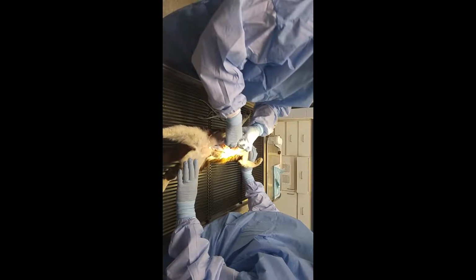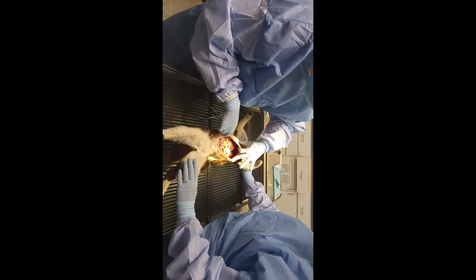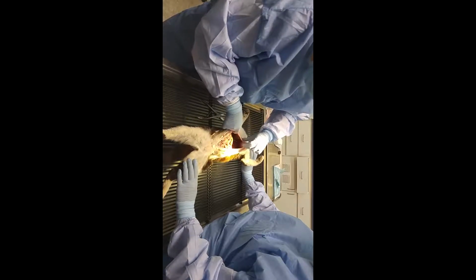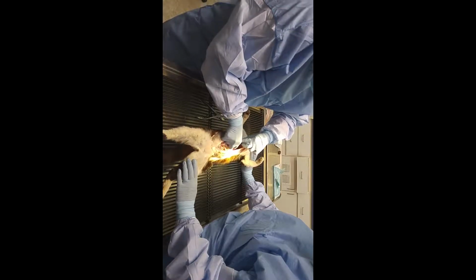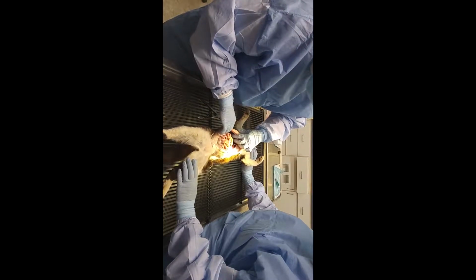So again, the first thing we're going to do is just peek at everything in there and see how things are looking. Is there any evidence of fluid? We can see the liver here, which appears normal. And not only do we look at how it looks, but we also want to touch it and see how does it feel. Does it feel normal? Is it hard? But it's nice and smooth.